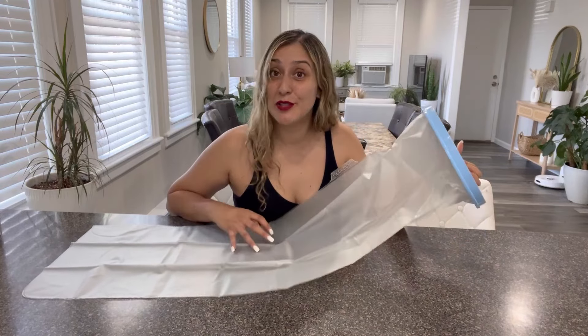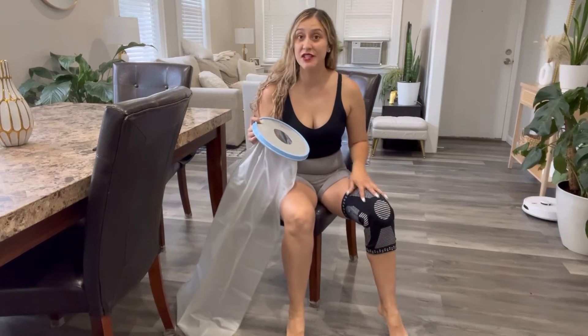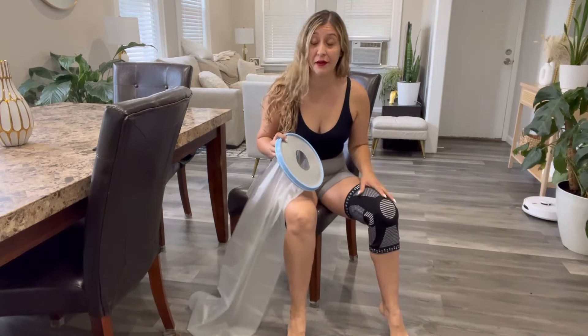So let me show you now how to put it on. As you can see, I am wearing a bandage on my knee, and I want to take a shower without having to remove my bandage. This product is great if you're wearing a cast or bandages, or even if you have some sort of skin condition and you need to keep water away from the wound area.